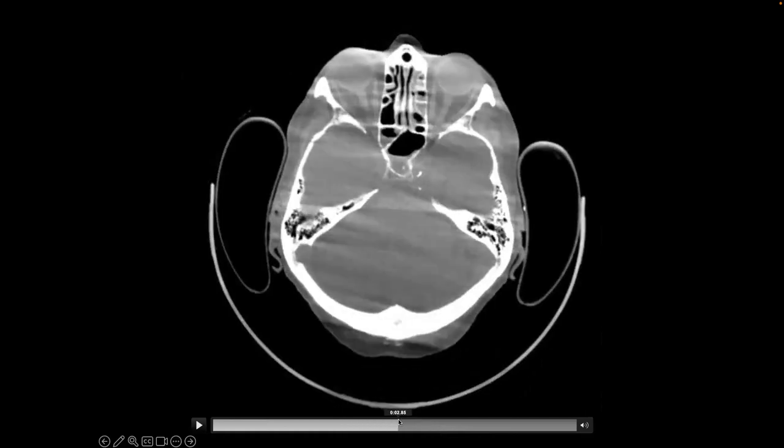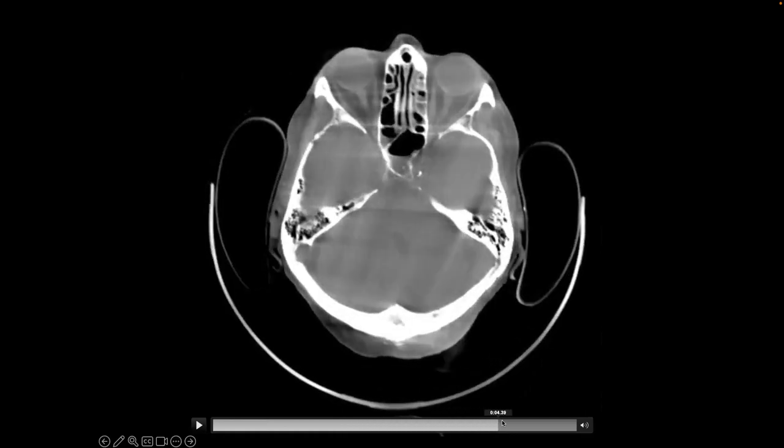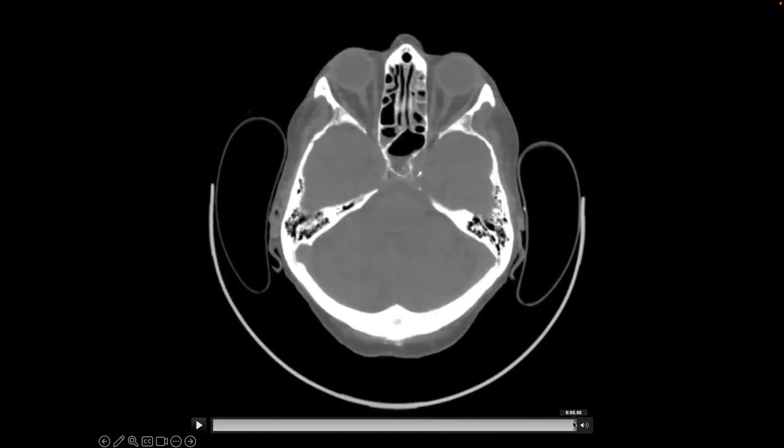And so we really don't know anything about what the content is in this direction, other than very rough estimates. So as we add those up and rotate, we see that details fill in at different angles. And this is using a form of back projection called convolution back projection, which we will now learn.